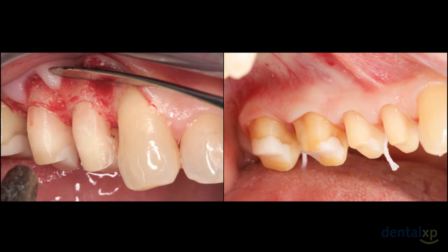The preparation on these teeth is a light chamfer with a 0.3 of a millimeter margin supragingival to the tissue, just supragingival to the gingival collar. We do not place our margins in the sulcus.